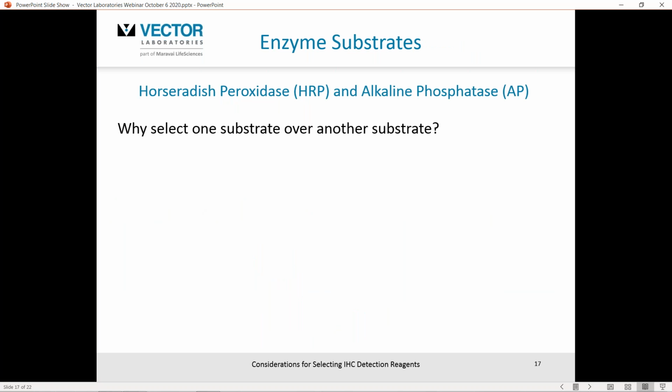Okay, quick word about enzyme substrates. Why would I want to select one over the other? Well, as we showed earlier on with the DAB, sensitivity, and certainly moving from possibly a powder or a tablet format to a liquid format would potentially generate a greater degree of sensitivity and be an easy increase for you in terms of sensitivity from your 1+ to your 3+ or something like that. Have a look at the precipitate characteristics.